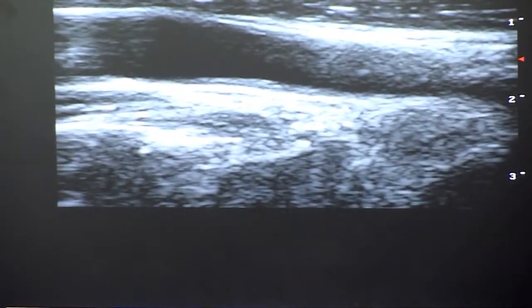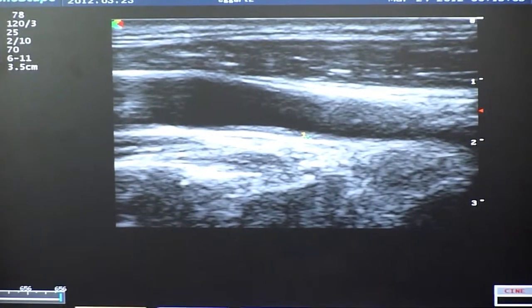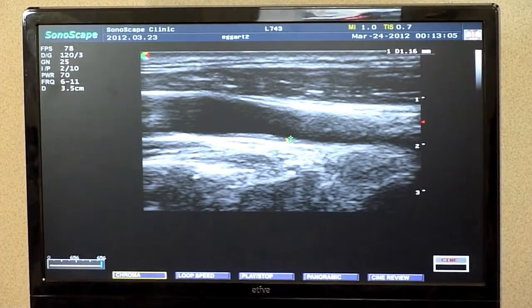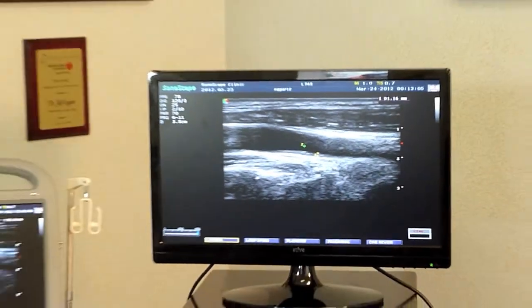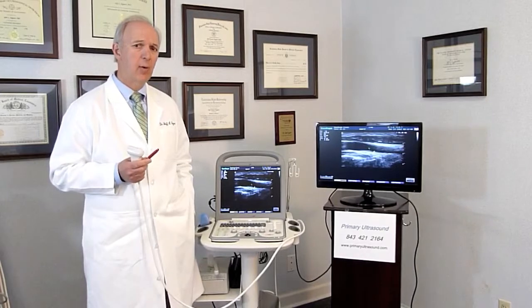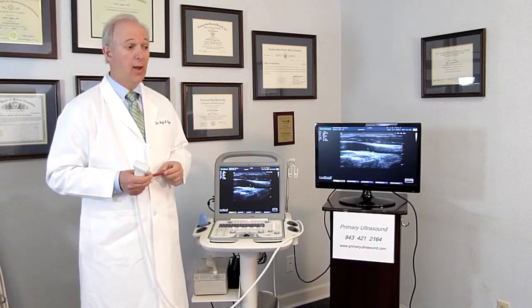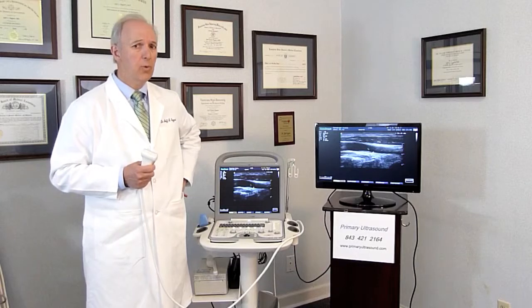We call this the carotid IMT, and we can measure it. For example, that measurement is 1.16 millimeters — that's thicker than in most men my age, so I have greater risk of coronary disease than a typical man. It also raises the question of how my coronary arteries are, and I may want to do some other studies. We're actually measuring early disease when you do a carotid IMT. We've scanned the entire emergency department and the firemen of our community — 48 men — and found carotid plaque in quite a few of them. We've also used the same technology in screening our local dental society.